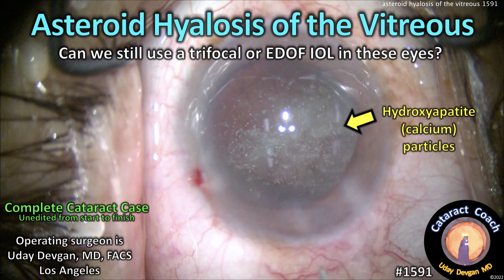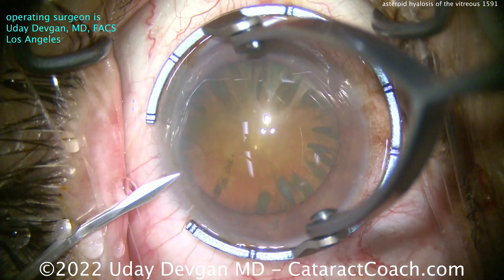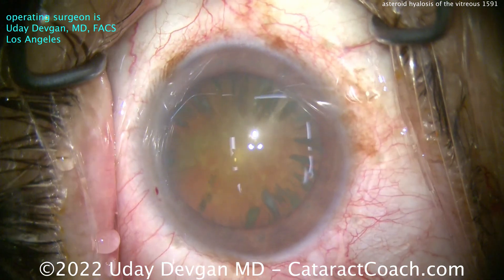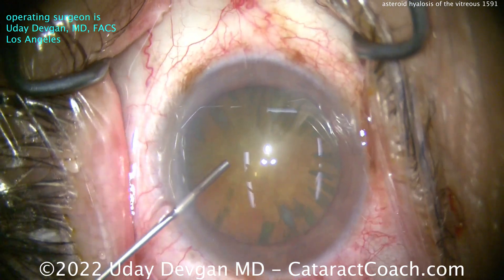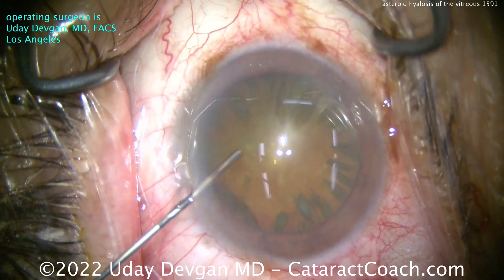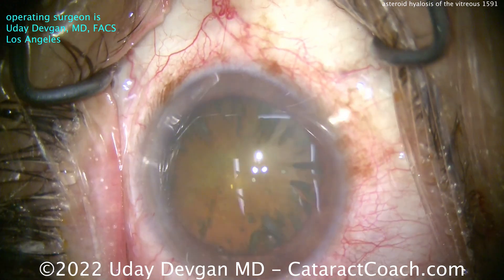CataractCoach.com. Asteroid hyalosis of the vitreous — can we still use a trifocal or EDOF lens in these eyes? Take a look at this patient who has cataracts. Look back in the vitreous cavity and you can see those refractile little white spots, those little bodies. That's asteroid hyalosis.